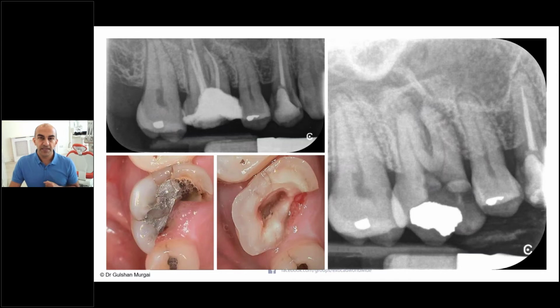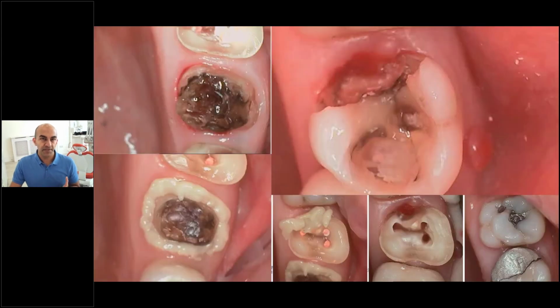Here again is one of my cases, an endodontic complex case, which if you look at the bottom left-hand image, a lot of practitioners might say, I'm afraid that cannot be saved. We've been able over the years, I've been doing this 16 years now, ChairsideCAD, with different systems, I've been able to really push the boundaries. So a case like this, I've done an endodontic treatment, I've left the site to heal for a few weeks, got the patient back in, scanned, designed and manufactured at the same time. This particular patient had 3 restorations done in a single visit. The root treatments were done separately though.